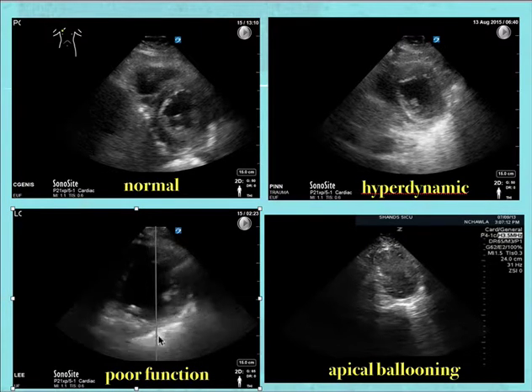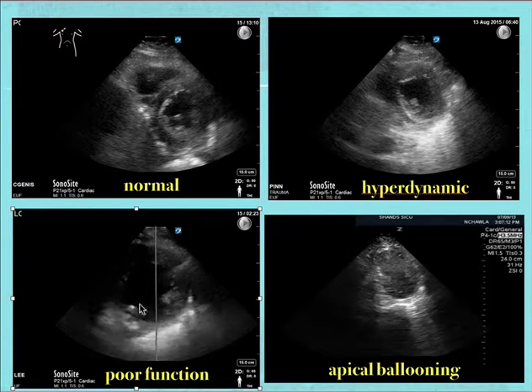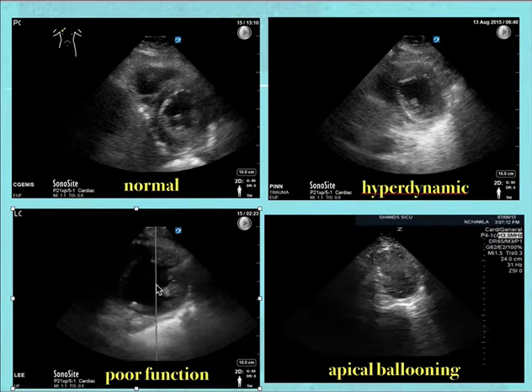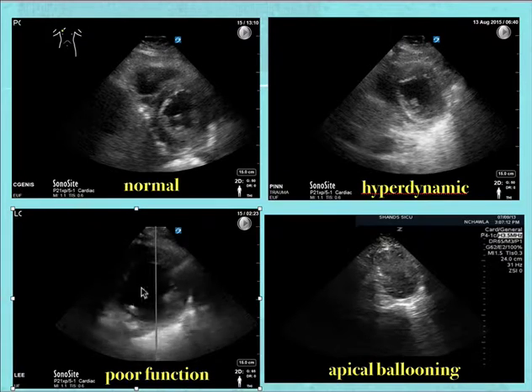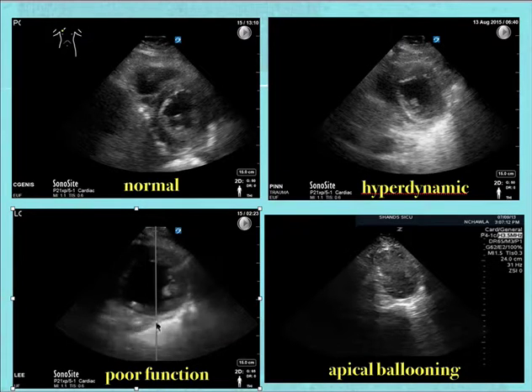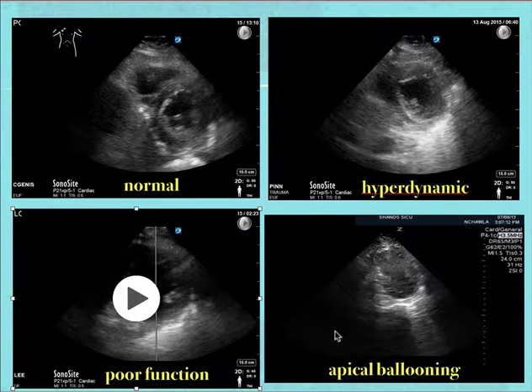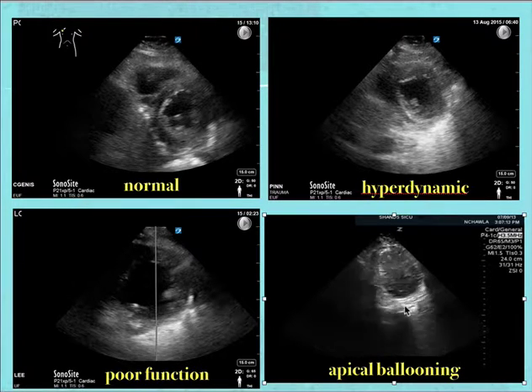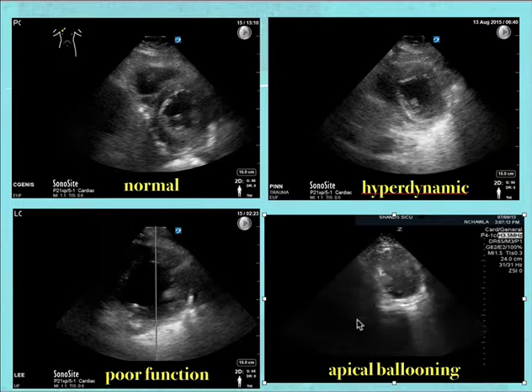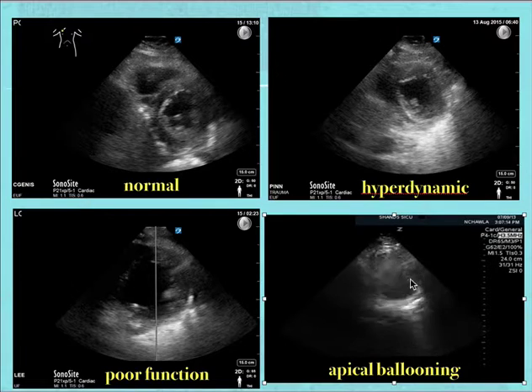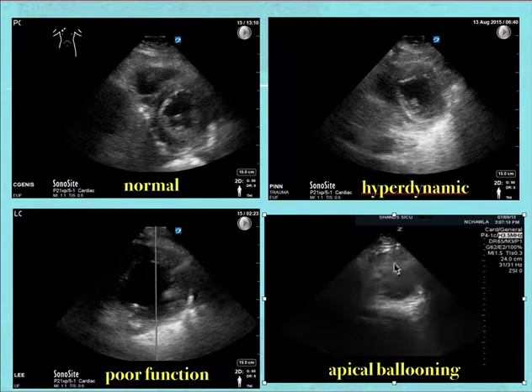Here's the left ventricle in poor function at short axis — you see the papillary muscles, volume in the left ventricle, and no collapsibility. Here's an apical ballooning example: we moved the short axis view toward the apex. Normally the apex is only small, but here you can actually see part of the apex ballooning out. This is apical ballooning, something seen a few times in practice.